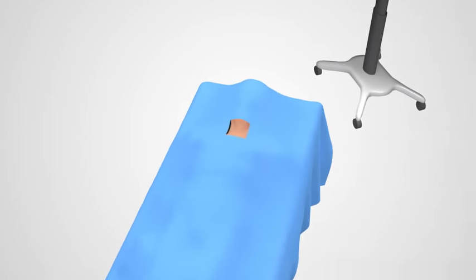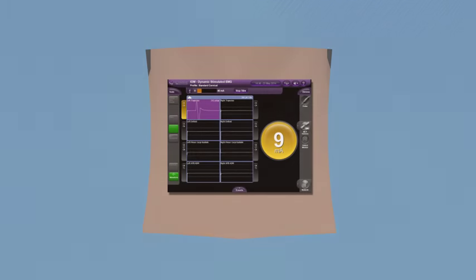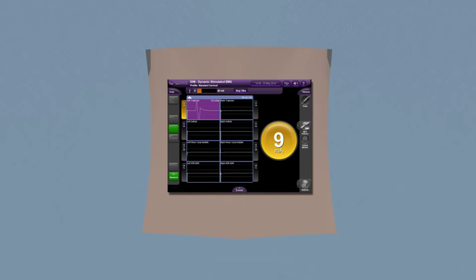The procedure begins with you being positioned on your back and draped. An x-ray is taken of your spine to identify the location of the operative levels. Neuromonitoring may be used to monitor disturbances to nerves or the spinal cord during this procedure.